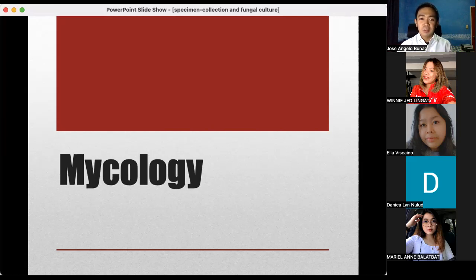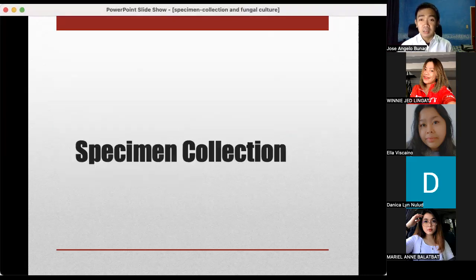So for mycology, it is very essential for us to collect appropriate specimen because this is considered to be the primary criterion for accurate diagnosis of mycotic infection.